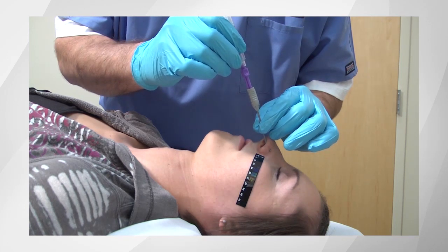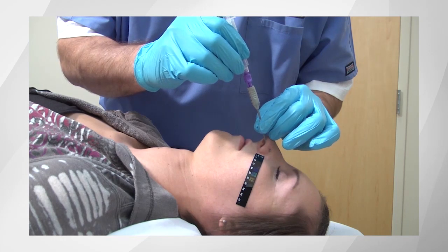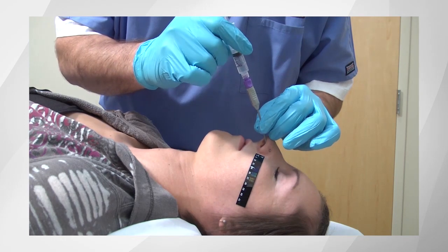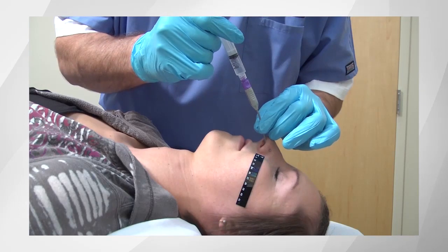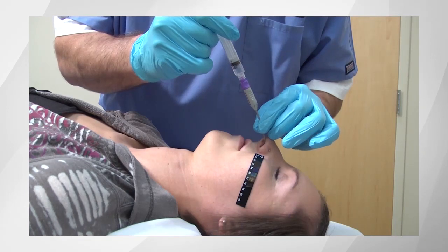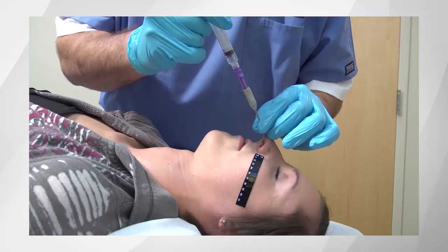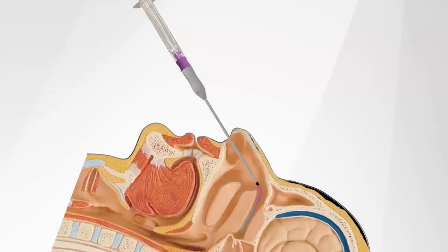Retract the inner catheter by separating the hubs. Pull the entire device back at least 1 centimeter. Then advance the device until nasal bone resistance is felt as previously instructed. Withdraw the catheter 1 centimeter. Deploy the inner catheter, and then begin injection when the patient is ready. If the head is appropriately tilted back and the catheter is correctly positioned, little or no lidocaine should run down the throat until after the procedure and the patient sits up.